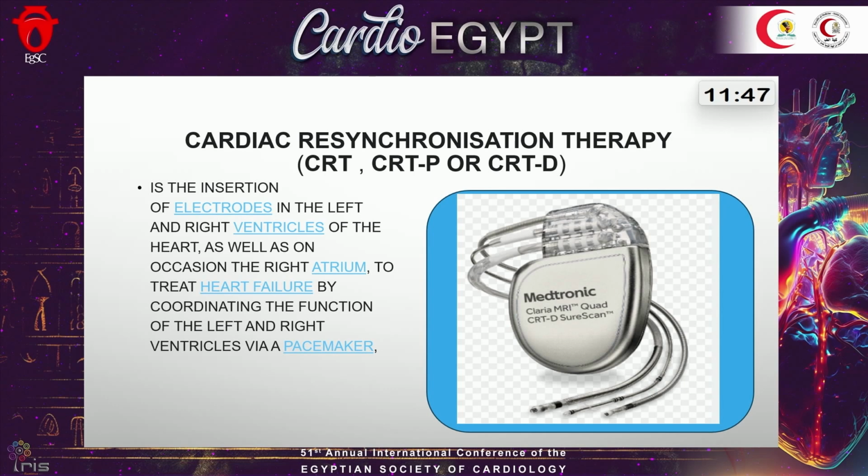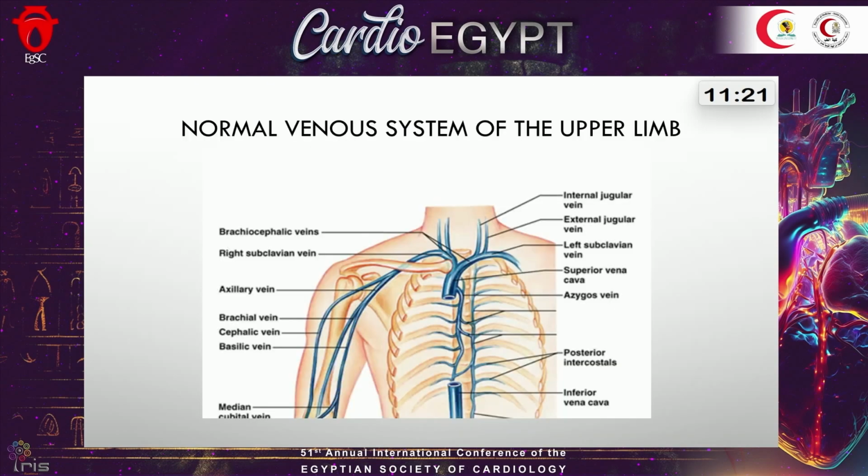First, thanks to Iris for this invitation, and this is a great honor for me to stand in front of you. CRT therapy: what is CRT, or cardiac resynchronization therapy? It is the insertion of electrodes in the left and right ventricles, as well as on occasion in the right atrium, to treat heart failure patients by coordinating the function of both right and left ventricles via a pacemaker.